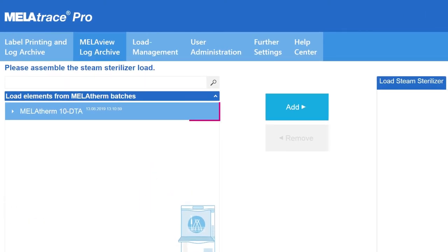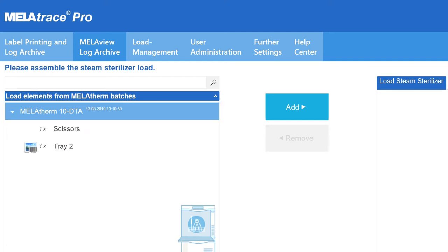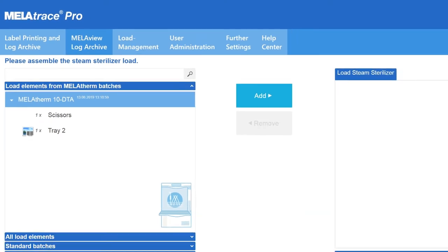MELAtherm batches already approved will be displayed. Click on the small triangle to open the load configuration. In this example, tray 2 should be placed in a sterilization container.